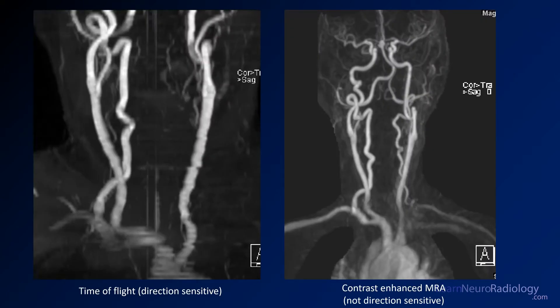Here you see the two types of images. On the left we have a time-of-flight MRA, which is direction sensitive, so what you see is an absence of the vertebral artery on that side. On the right is a contrast-enhanced MRA — you can tell because the resolution is much better and the vessels look cleaner. Now you see the vessel is present, but there's absence of the proximal subclavian and very poor filling of the artery down the arm.